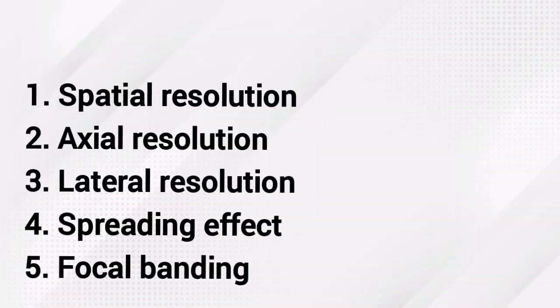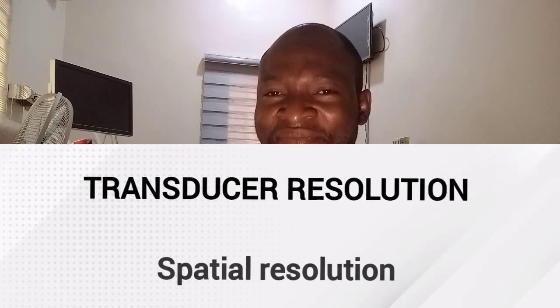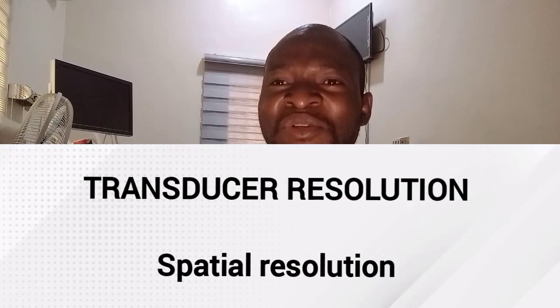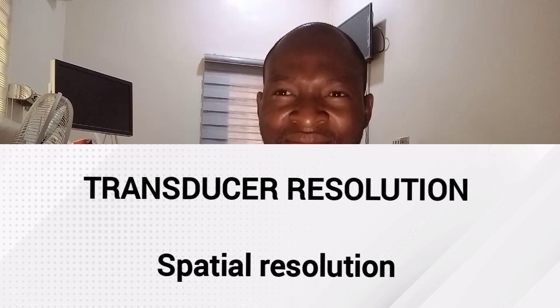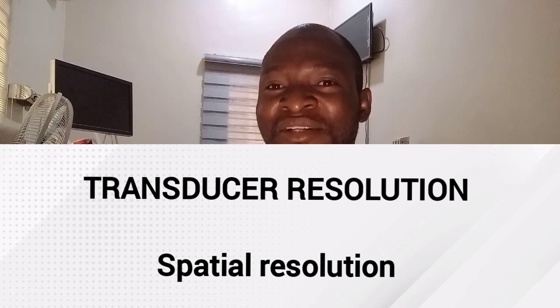So transducer, let's look at transducer resolution: spatial resolution, point spreading effect, and focal banding. Poor spatial resolution is an artifact, since a failure to resolve adjacent interfaces means a loss of detail, and two closely spaced interfaces are displayed as one echo rather than two.